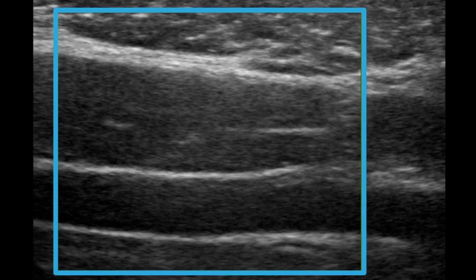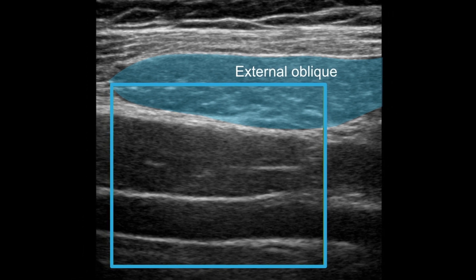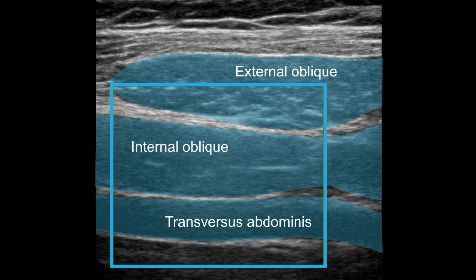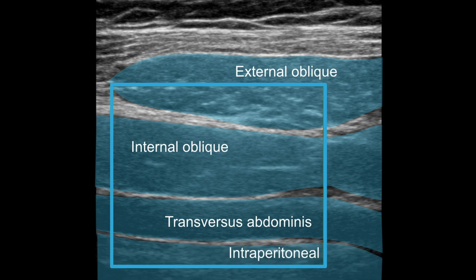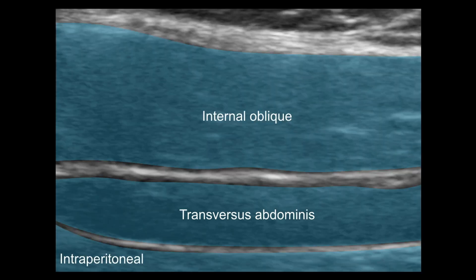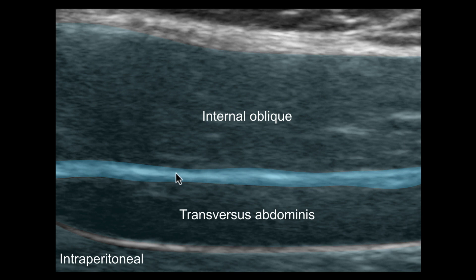Here we are zoomed in. Notice again the three muscles we just identified: one, two, three — external oblique, internal oblique, and then what we're looking for, the transversus abdominis muscle. The peritoneal space is just deep to that. Zoomed in further, we see the three muscle bellies and the peritoneal space deep to them. We don't need to go further than that — the only spot our needle needs to go is just beyond this fascial plane to achieve a successful TAP block.